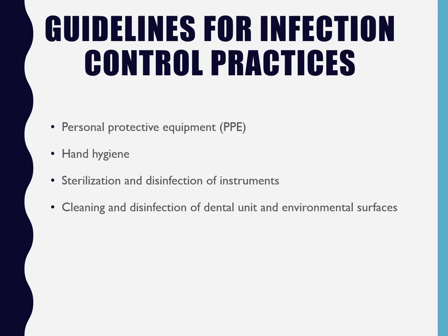Okay, so if you go to box 15-1, you'll see those infection control practices in the dental healthcare setting. Those go over some of all of the different types of practices that we use. The big ones will be the personal protective equipment, hand hygiene, sterilization and disinfection of instruments and surfaces, and then cleaning and disinfection of dental unit and environmental surfaces.